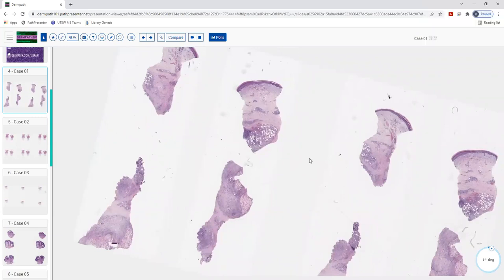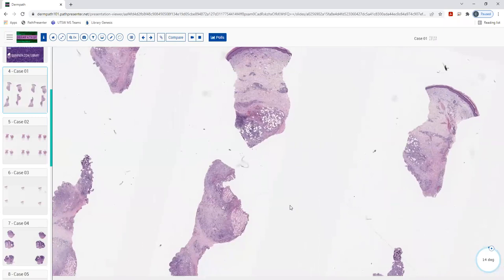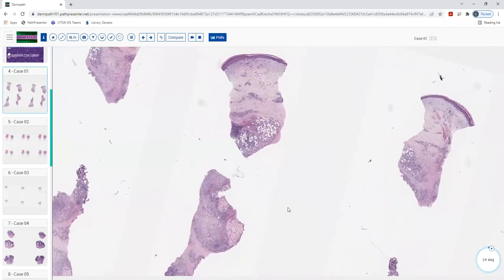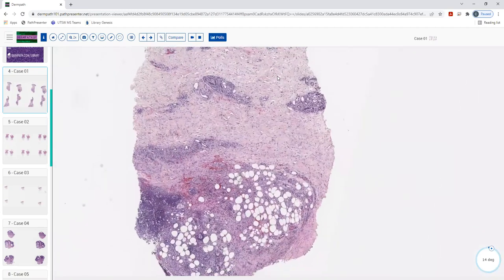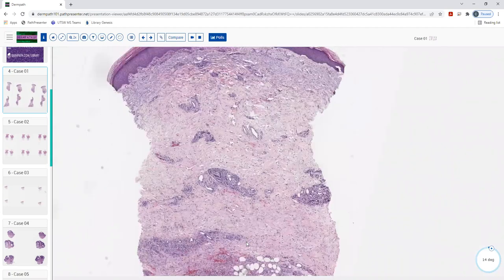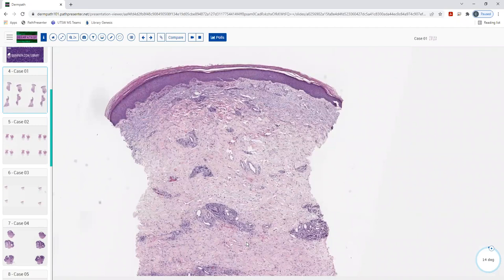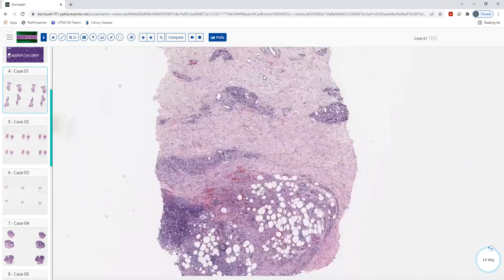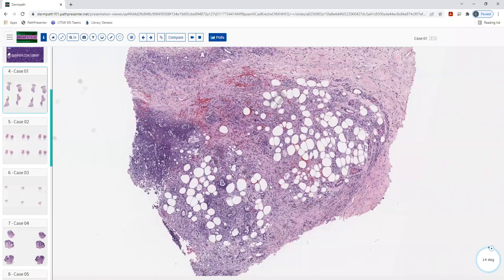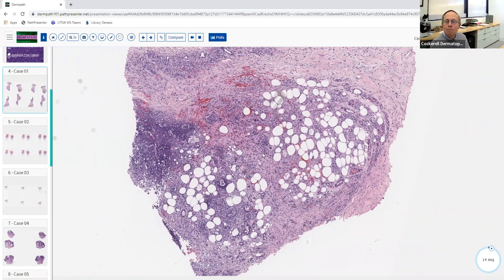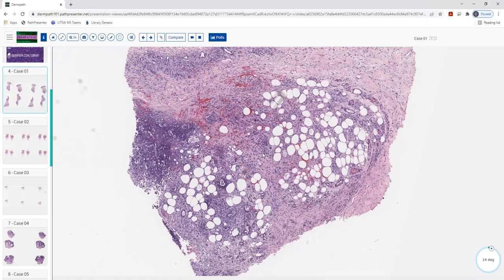It looks like we have a punch here. I would favor more of an inflammatory process. Most of the action seems to be concentrated in the subcutaneous area. Besides some perivascular inflammation and maybe some solar elastosis at the top, I don't see too much else. When we go down into the subcutaneous area, I see admixed with all the fat cells some sort of mixed inflammatory infiltrate going on. I also see some extravasated red blood cells and some focal basophilic areas. So I would classify this as a panniculitis of some sort.